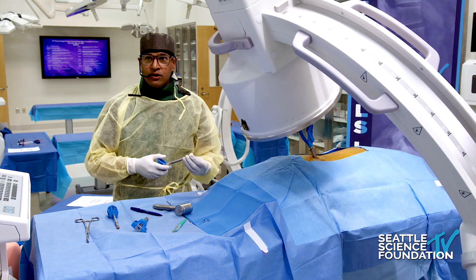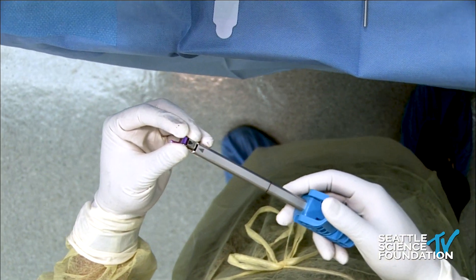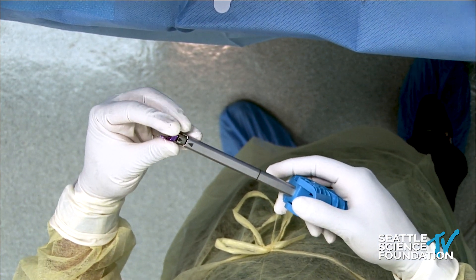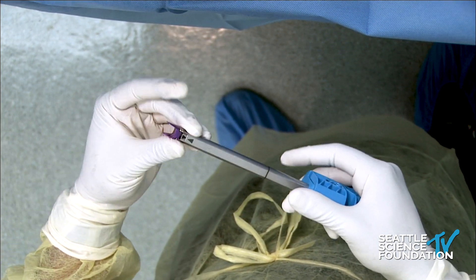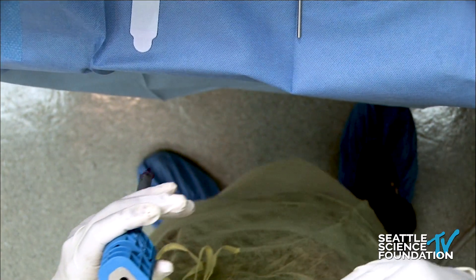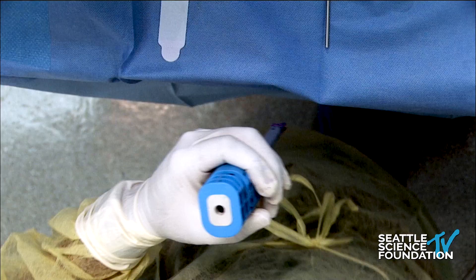One criticism of the IDE study is that there were a number of spinous process fractures on the order of 16%. Many surgeons bring that up, but I think we oversized. We've now optimized the procedure, so our number one sizes are 12 and 10. You don't need to distract — this is not a kyphosis-producing procedure. This is simply an extension blocker.